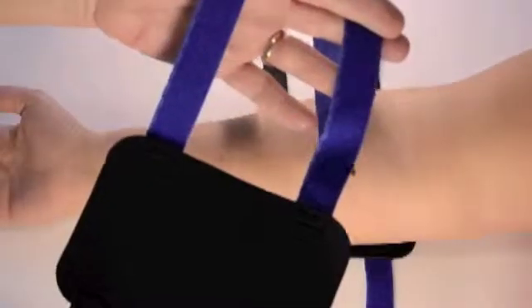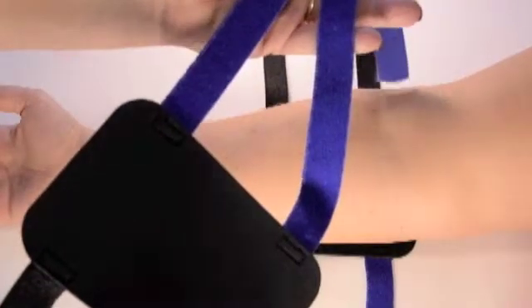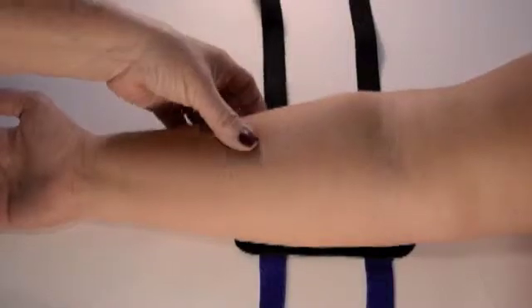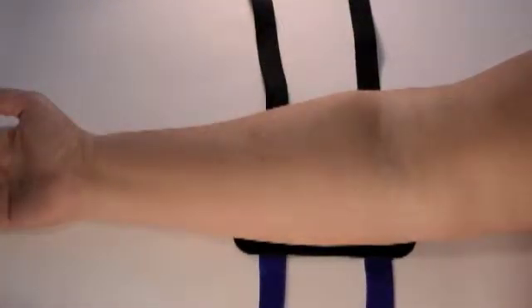Arm and leg hemodialysis needle fixation device: place the needle nurse saddle on the underside of the arm with the soft side against the arm. Lay out the straps flat to their full extent with the blue straps aligned to the inside of the arm. Clean and prepare the arm area according to the clinic policy, then cannulate the access.